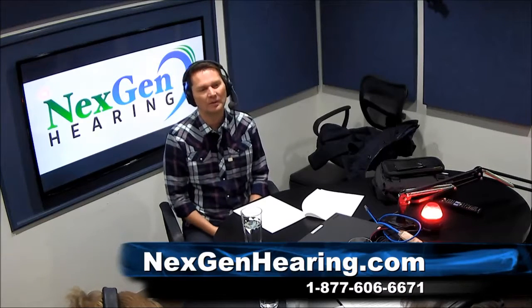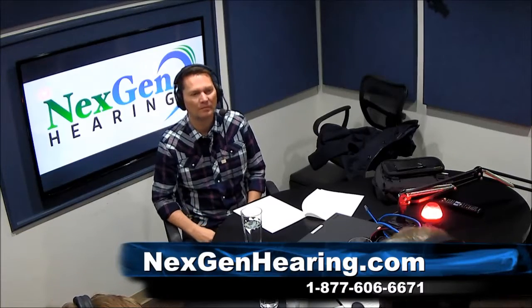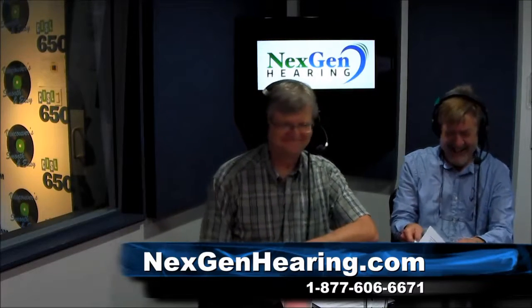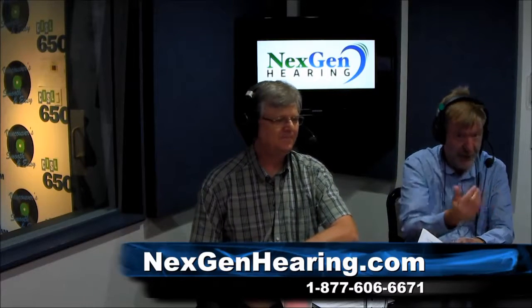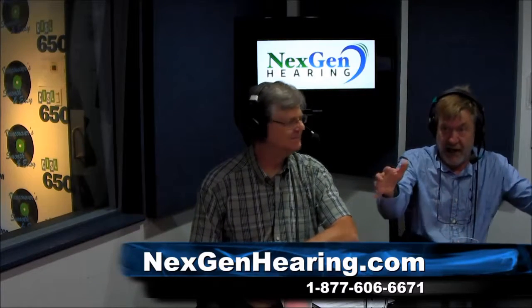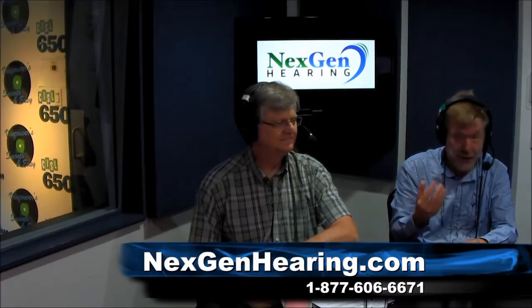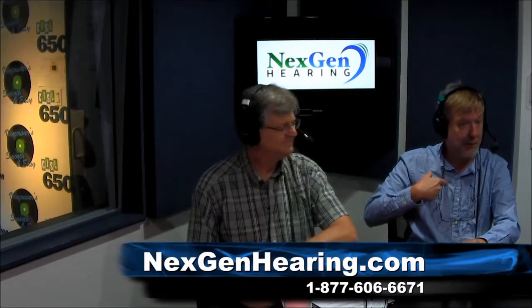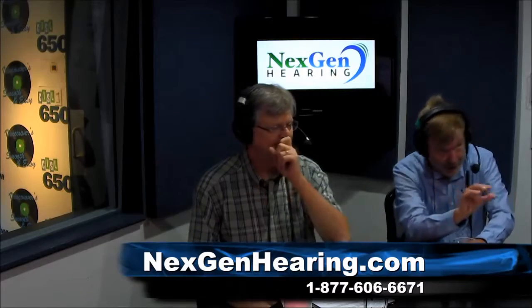Yes, the spouse would wear the mic, and then, let's say it's the husband who's hard of hearing. He can hear everywhere he goes. It's good at restaurants. You can imagine sitting across a table from a significant other, and you've got a clatter of knives and forks around you, and you don't want all of that stuff picked up. So you're getting the speaker's voice that's going right into his or her lapel microphone, streamed by Bluetooth, again, wirelessly, right into your hearing aids.